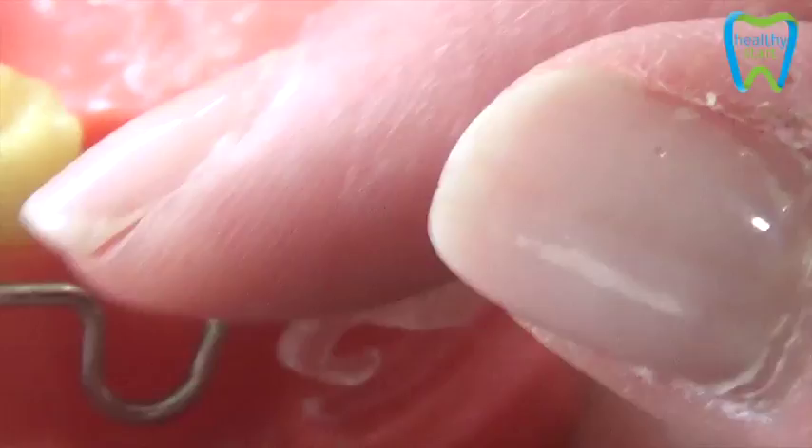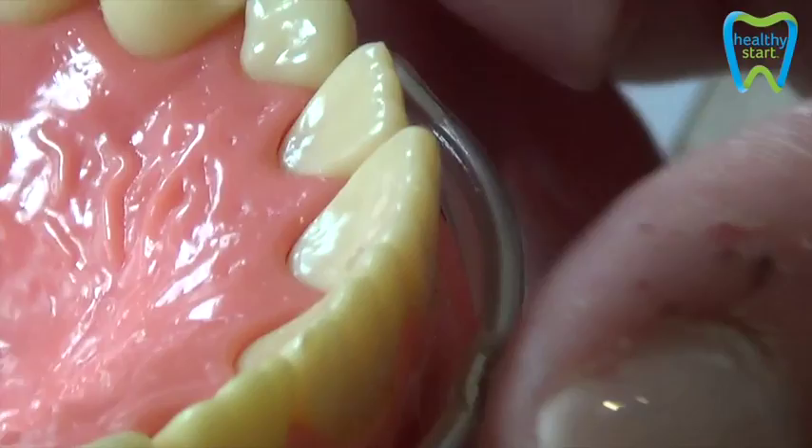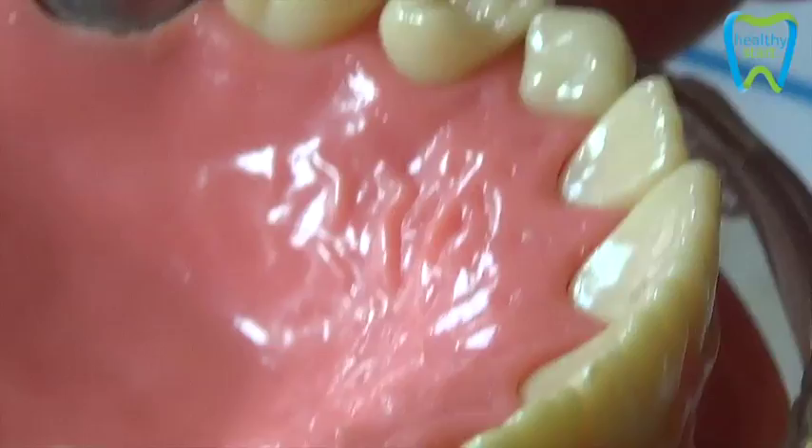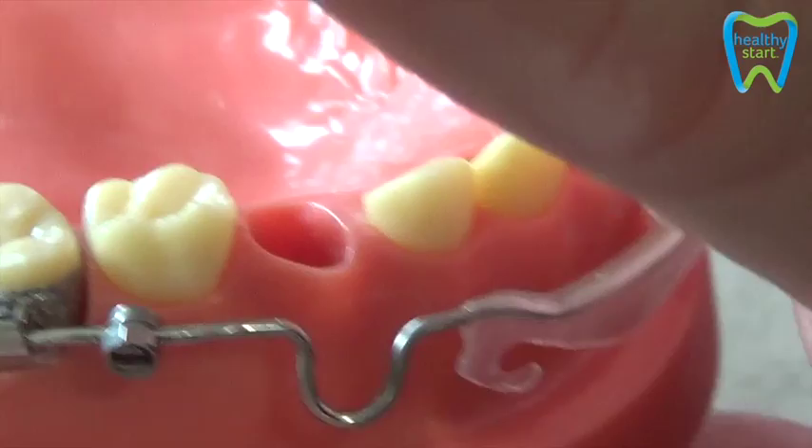Tighten it right up. Then they wear it for the first month — they're going to take their lip and push on that bumper, and it's going to distalize those molars. That lock creates the friction in order to drive those molars back. After a month, you're going to loosen the Gurren Lock, slide it back, create the space you need, and in that month the lip is going to drive those molars back. If you need a third month, they come back — you move it forward again and slip the Gurren Locks up against that tubular band.